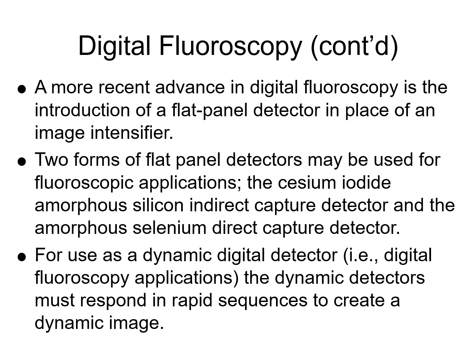The amorphous silicon is called an active matrix flat panel array, and it's got TFT arrays and gate control circuits, but it's got individual data dump lines. Instead of one data dump at the end of the row, only one pixel will use the data dump line at a time, so we don't get noise from one pixel affecting another pixel.